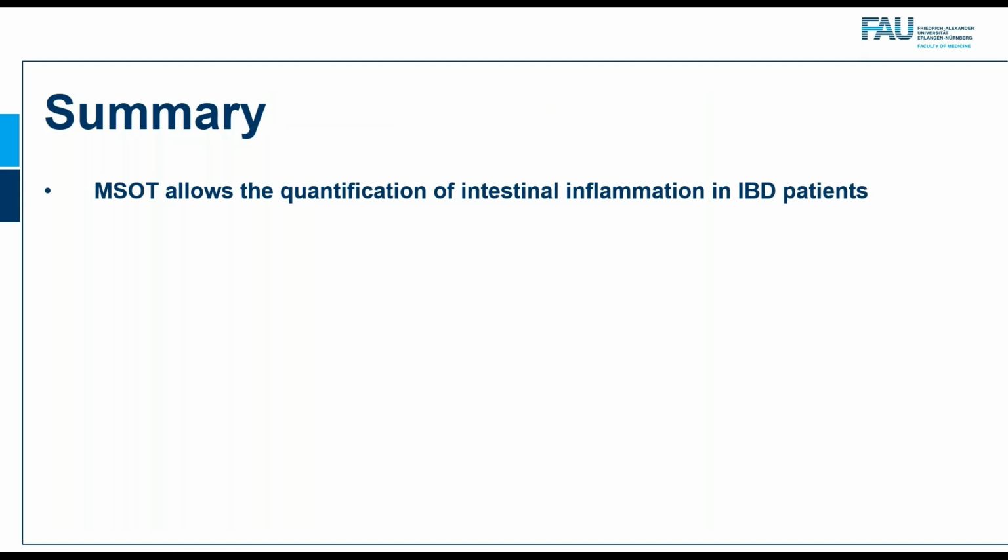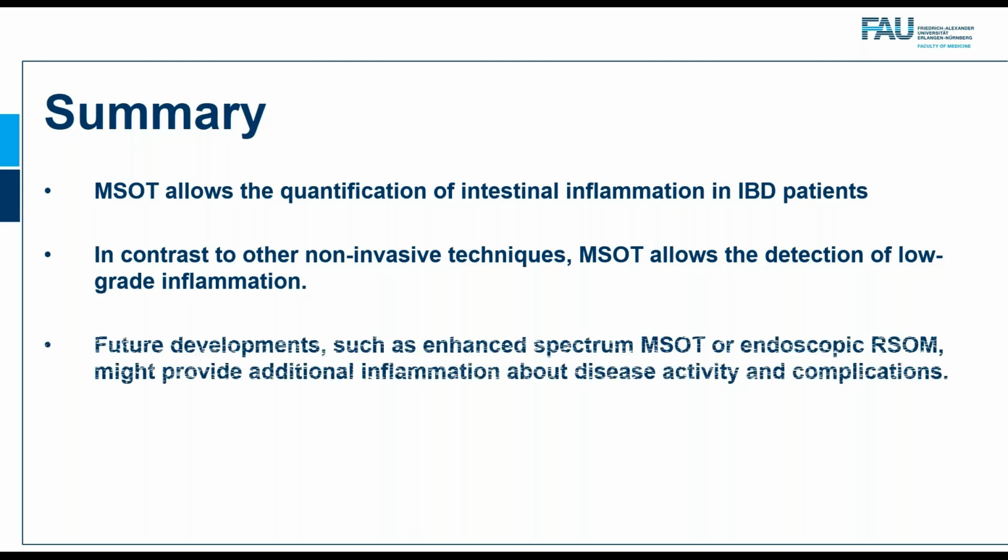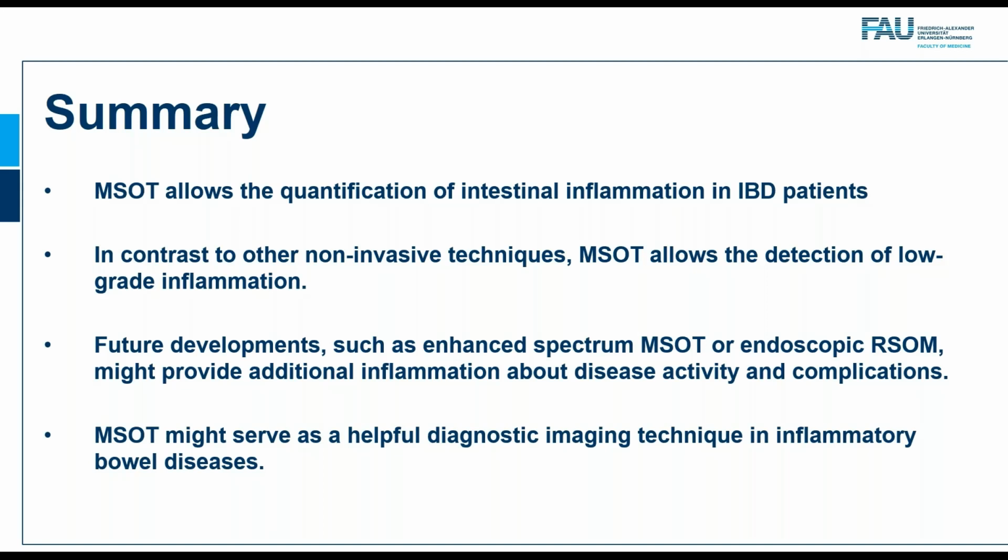To sum all this up, I want to say that MSOT allows the quantification of intestinal inflammation in IBD patients, and that in contrast to other non-invasive techniques, MSOT also allows the detection of low-grade inflammation, which is a feature that is extremely helpful in a clinical setting. Future developments such as enhanced spectrum MSOT or endoscopic RSOM might provide additional information about the disease activity and about complications. And MSOT might serve as a helpful diagnostic imaging technique in inflammatory bowel diseases in future times.